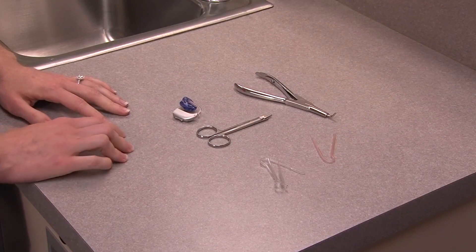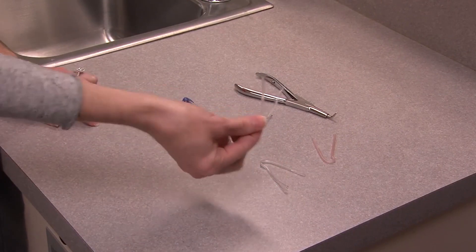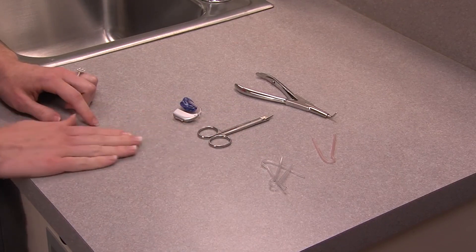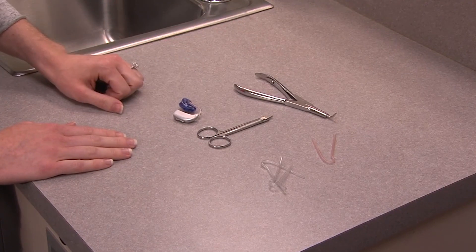The supplies that you will need to change the ear mold tubing are extra tubing that your audiologist should have provided, a pair of scissors, and you may find that you need something to open the tubing of the ear mold.